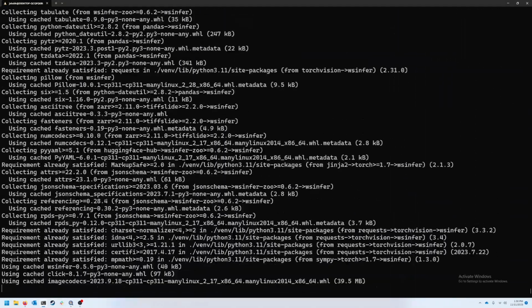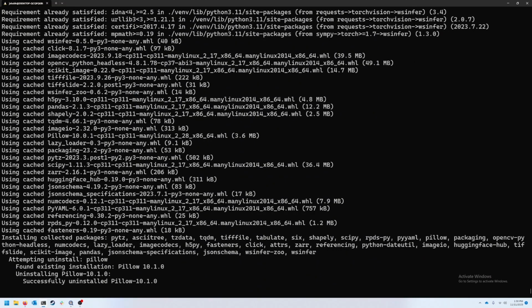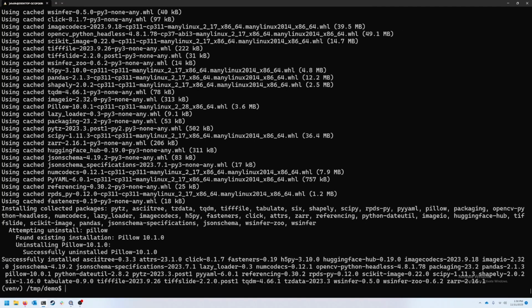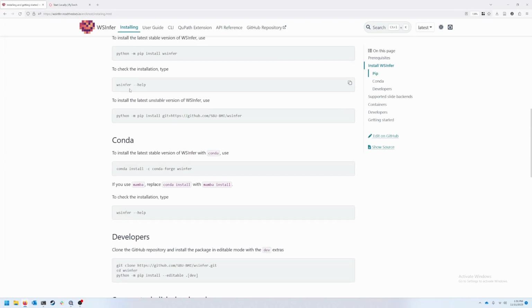We'll wait for that. That will pull in all of the dependencies as well. And to be honest, it will also pull in PyTorch if PyTorch isn't installed. But we would like users to install PyTorch first so that they're installing the appropriate PyTorch for their system. Right, like a pip install PyTorch will not necessarily install CUDA, for example. So that's the main reason.